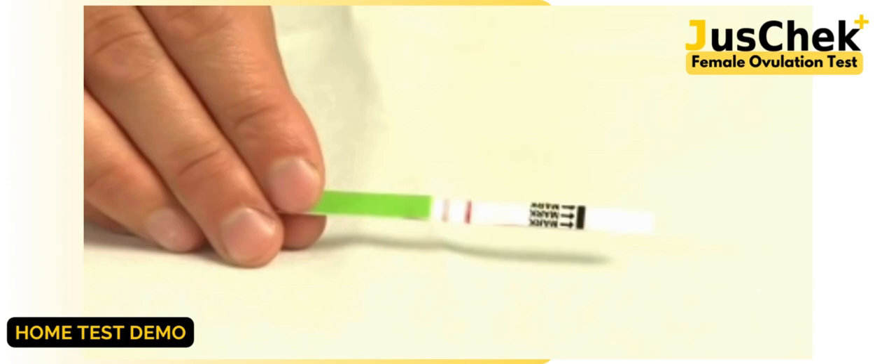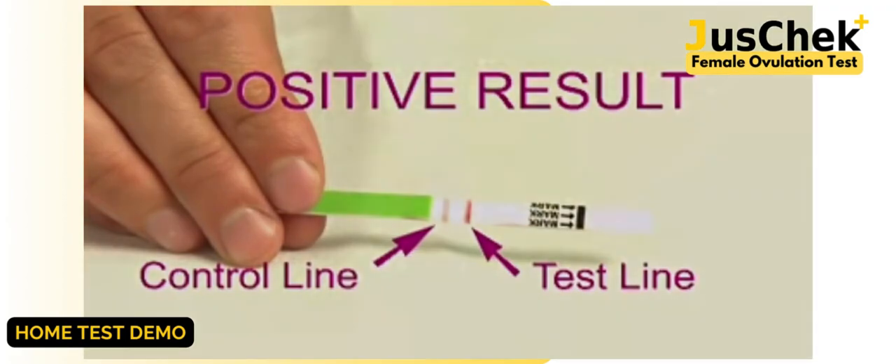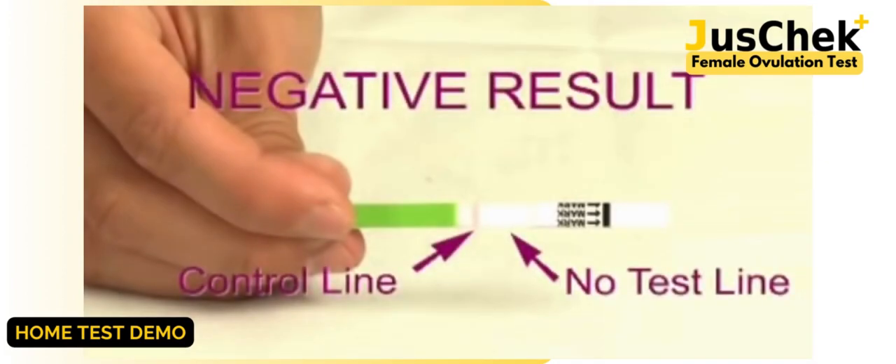If the test line is less dark than the control line, or if it can't be seen at all, that indicates a negative result. Here's an example of a positive result — note that the test line is darker than the control line. Here's an example of a negative result — note that only the control line is visible and no test line can be seen.